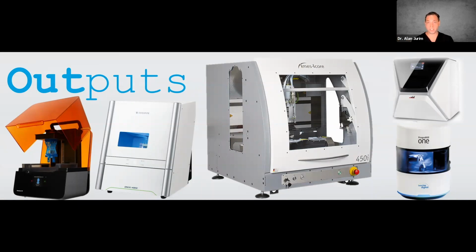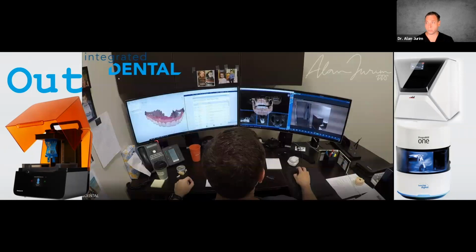There's another one that always gets overlooked, and that's just your computer screens. Digital dentistry gives us the ability to align data, to look at those different aligned data sets, to learn what's happened as a result or what may happen, and to predict a patient's future condition. Those are some of the key parts of digital dentistry. So we never have to always say that you have to print this, you have to mill this. The idea is that we have these important outputs, and this is where we make use of the data and the processing that we have done.